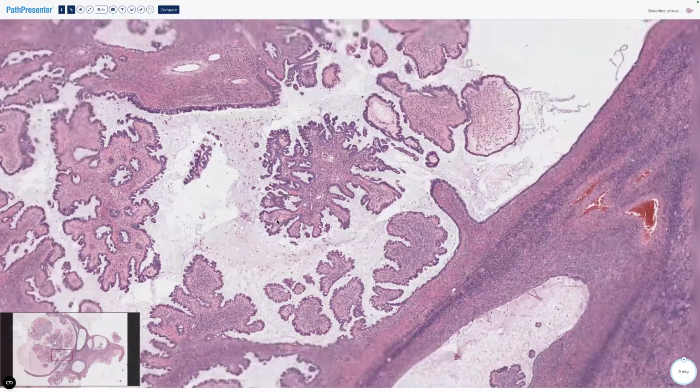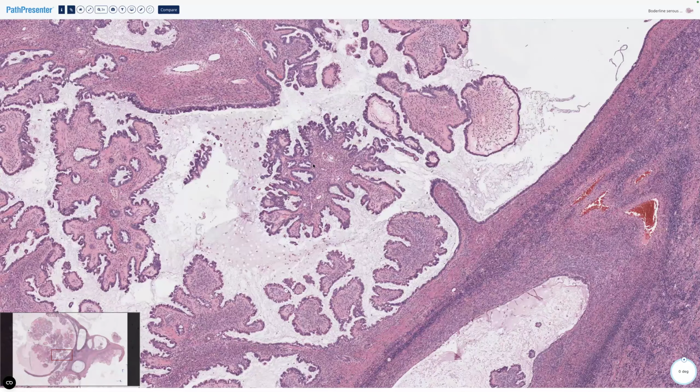So what are the bad prognostic factors? Well, I've mentioned this arborizing branching. There's a type of branching that is called Medusa head, and I'm going to demonstrate my beautiful Medusa head here. Okay, it's like a big round ball with long, long chains of thin, thin strips of epithelium coming off.